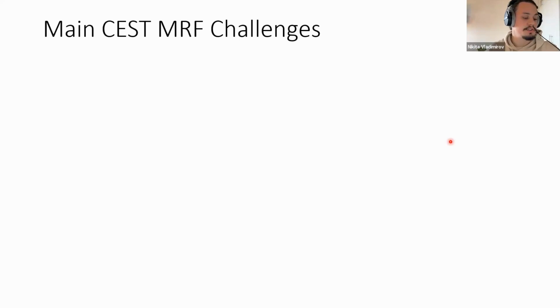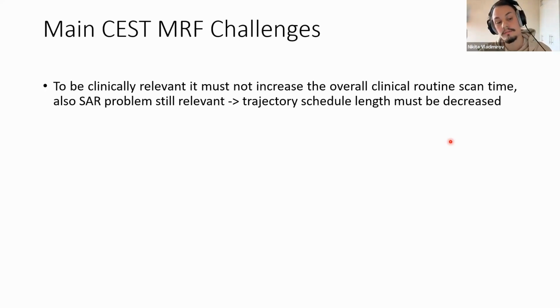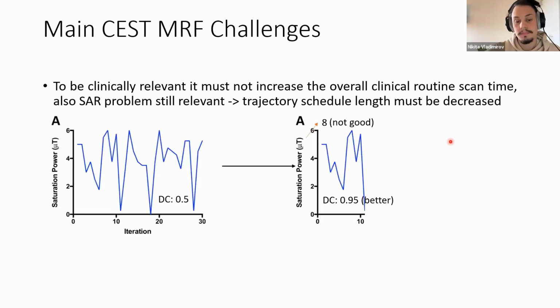The challenges with CEST MR-F are the following. The first is that, to be clinically relevant, it must not increase the overall routine scan time, because usually doctors scan T1, T2, some inversion recovery, and if our sequence is too long, everything will be too long. And also the SAR problem is still relevant. So we want to decrease the schedule length.